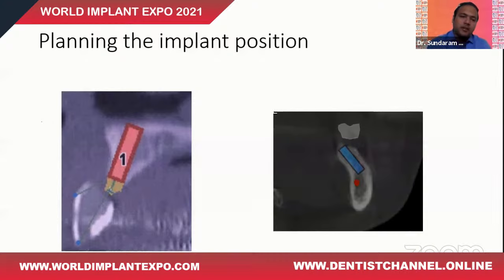Now, if this crown, for instance, is not present, I would probably get the implant placed in this direction because this is the area of convenience, where more bone is available. That is going to create a very unaesthetic appearance. You place an implant all right, but the superstructure of the crown is not going to come properly, and the treatment is a failure. Also, you can see in this picture a crown is going to come like this on top of it.